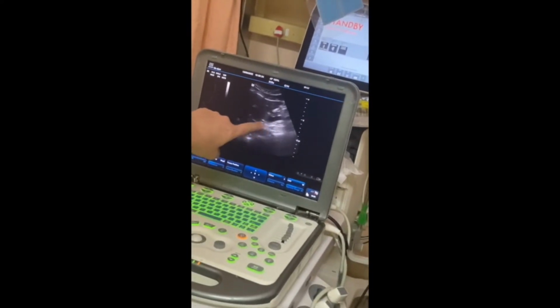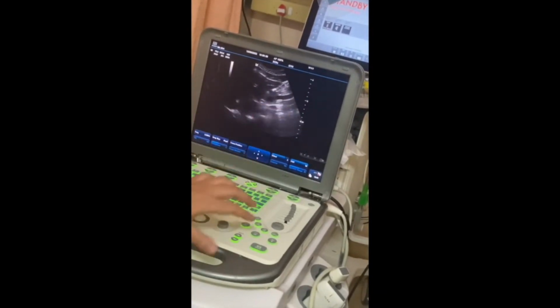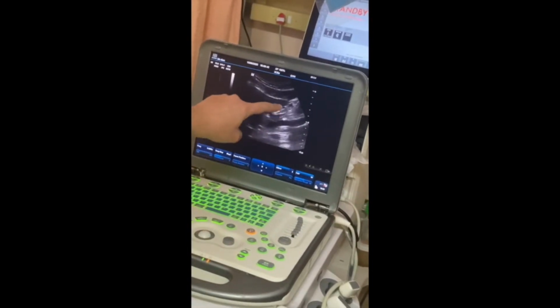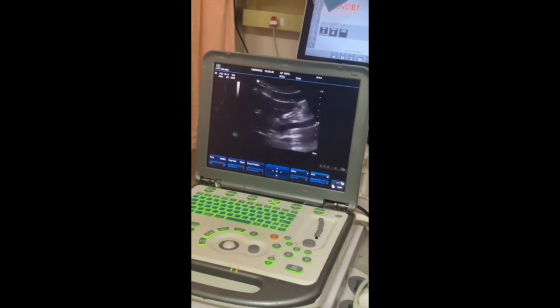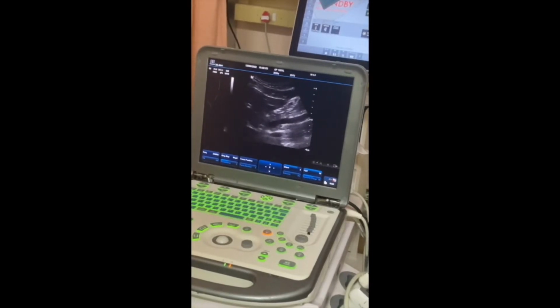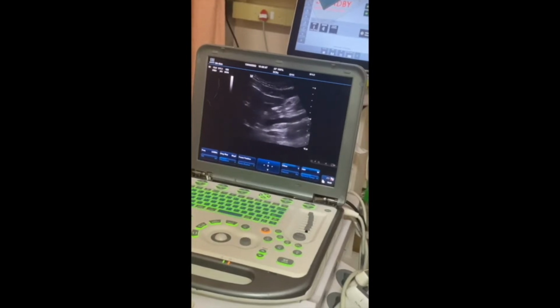And often above the aorta, you can also see the superior mesenteric artery. I'm just zooming in, and you will see this 5-layered gastric antrum. This is an empty gastric antrum. Once you've done it in the supine position, you cannot say that the stomach is empty. If, however, it's full here, you can then stop and say the stomach is full.